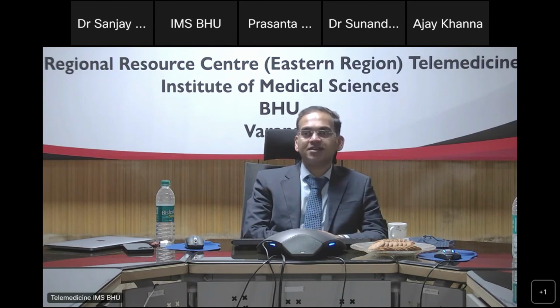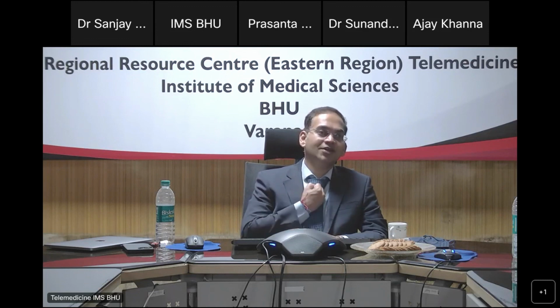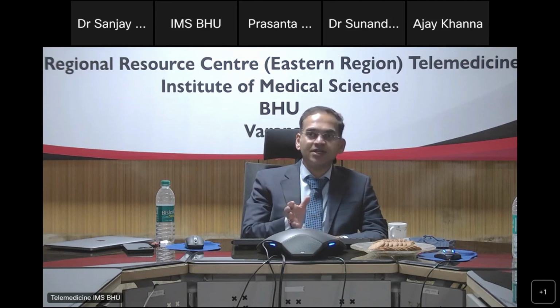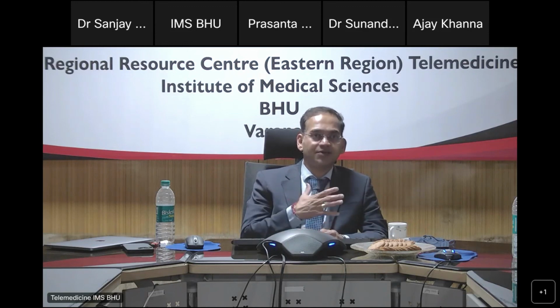First of all, second, it depends on when you're looking at thoracic aorta, ultrasound is not at all the modality because you will not be able to see the aorta. Even if you talk to a cardiologist who uses echo, they are only able to see the aortic root. So ultrasound is not a very good modality to look for the thoracic aorta.